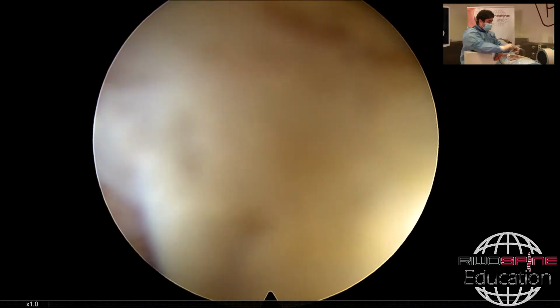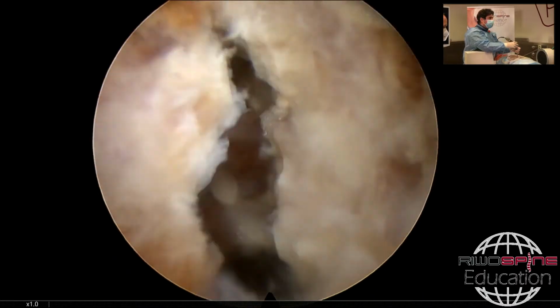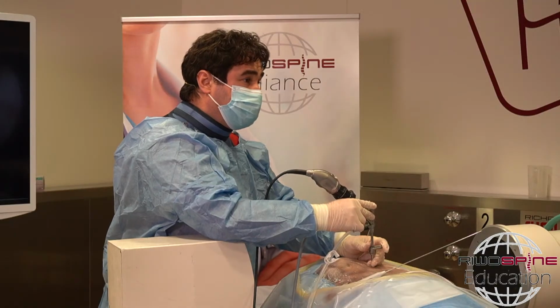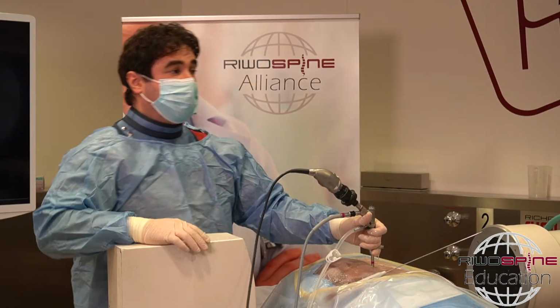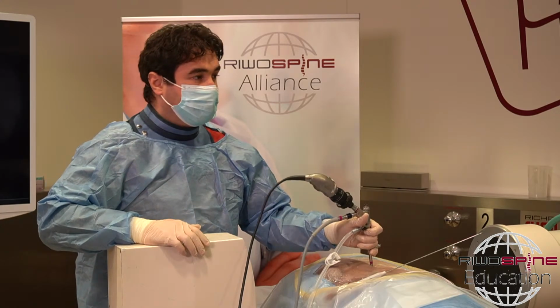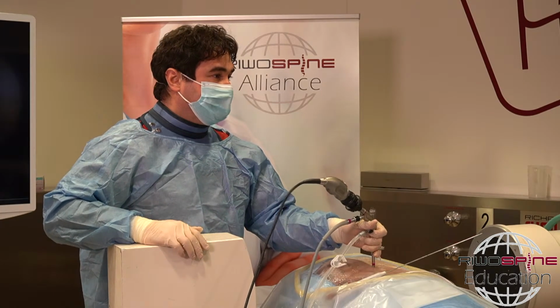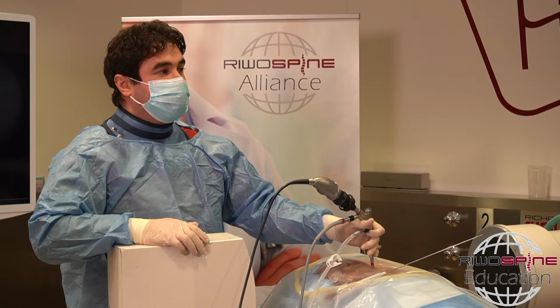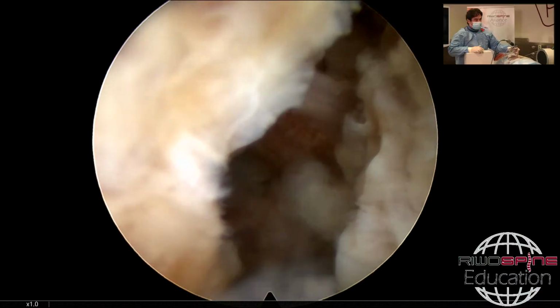Okay, now we have another option, of course, with the transforaminal approach. Even if you want to reach here, you have to do facet resection, and then, in my opinion, it's not very practical and easy to reach the axilla, and more than the axilla, the caudal side of the level.